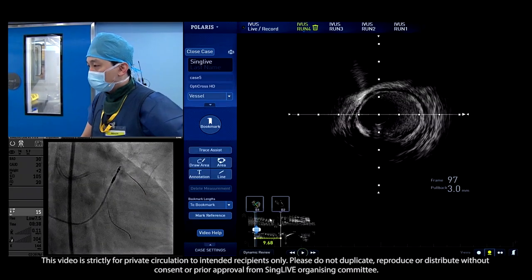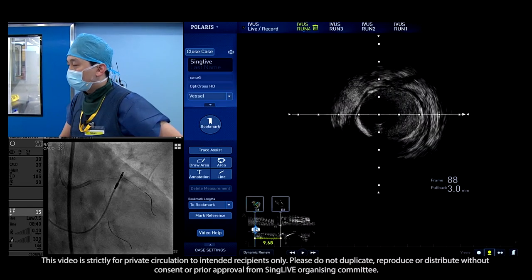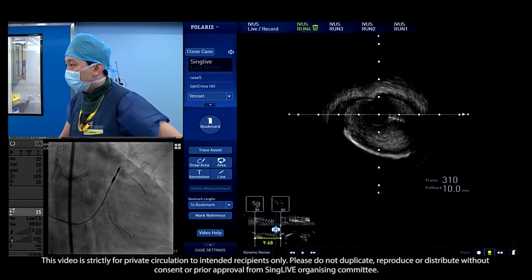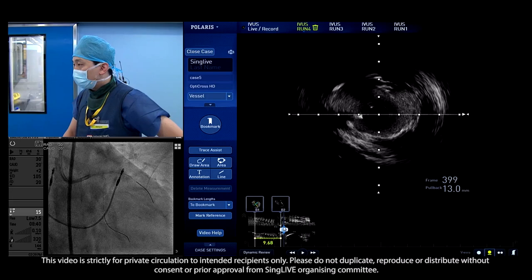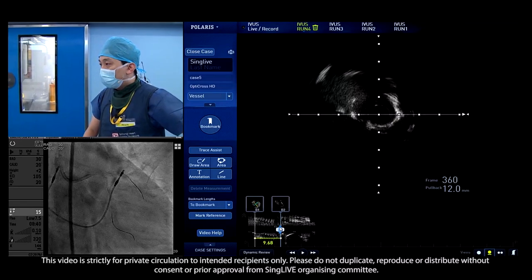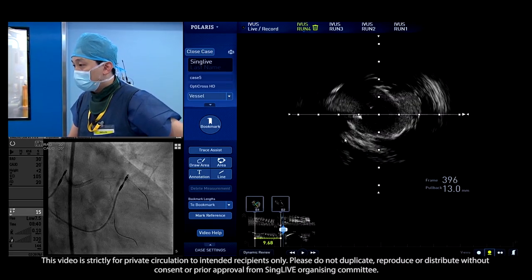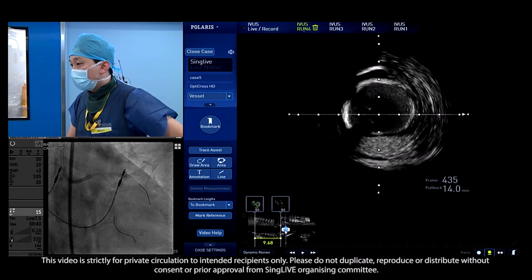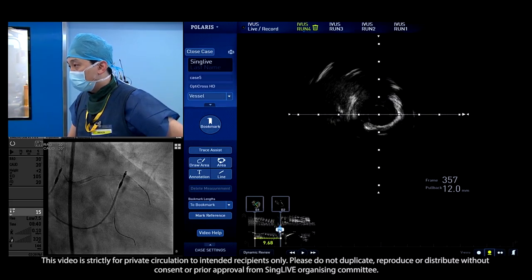There's nearly normal or just mild disease here. Vessel size 3.5 and lumen size just 3.1. And here, there's diffuse disease but intermediate stenosis of the circumflex. And at the ostium, there's very calcified disease, constricting the circumflex and adjacent to the left main. So, very complex anatomy, but it's after the main ballooning, so there's some calcium and dissections, and there's some hematoma and dissection of the left main. And I think it's better to hurry the procedure. For the circumflex ostium, there's very tight stenosis with calcification.